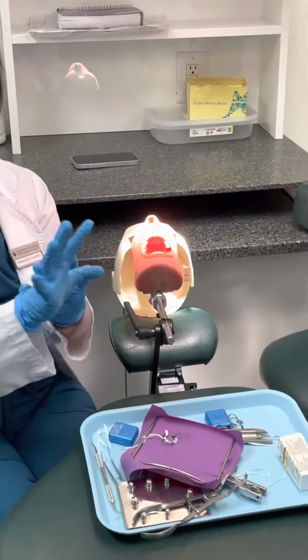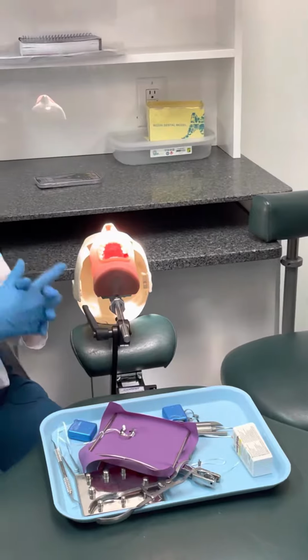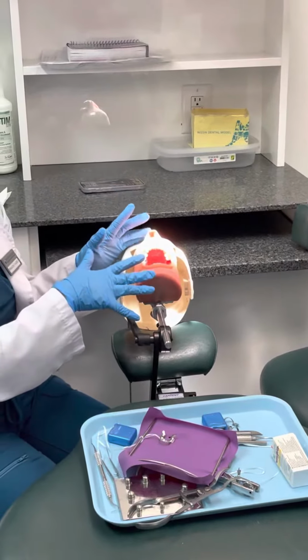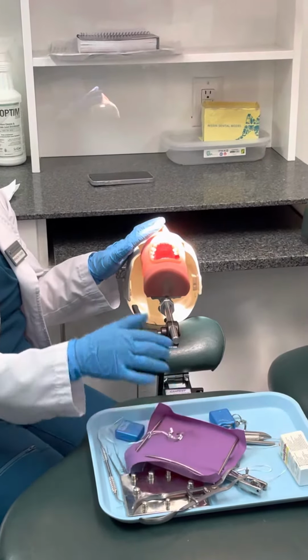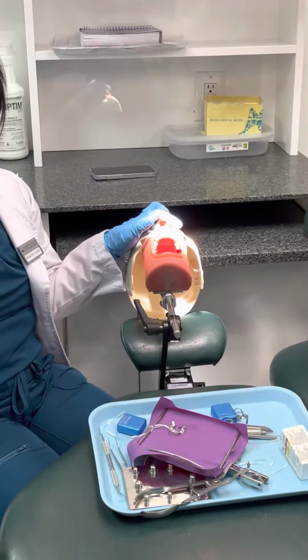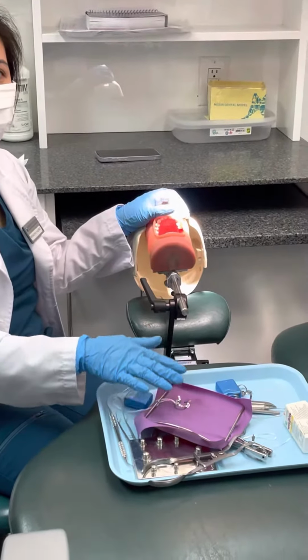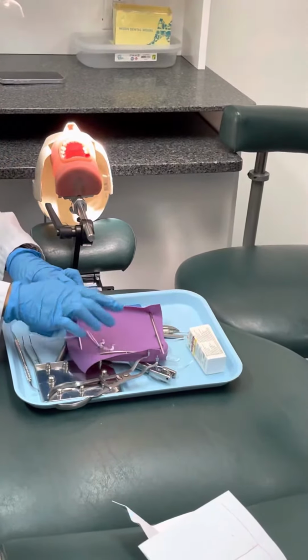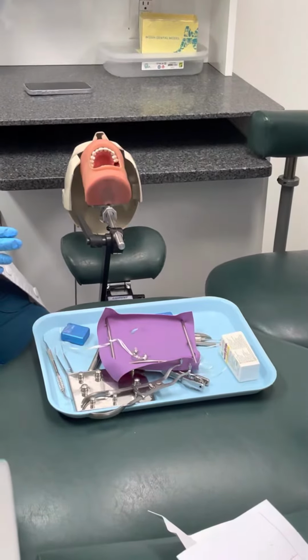That's why we have 3 other options of moisture control, because there are conditions of the mouth where we cannot use a dental dam. So if we cannot use a dental dam, we either use a saliva ejector, a cotton roll, or the dry angle. So what are the contraindications of dental dam? When can we not use dental dam?